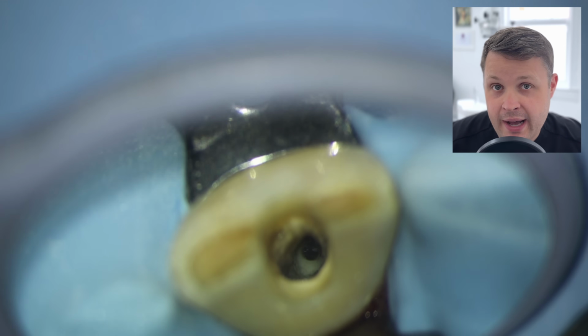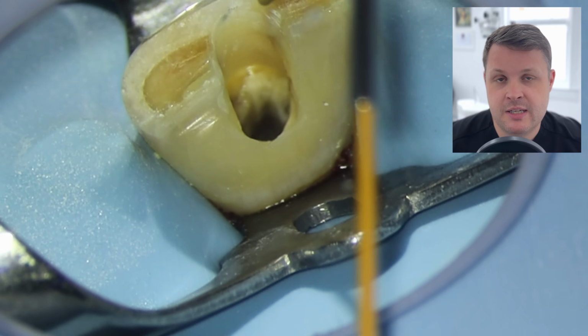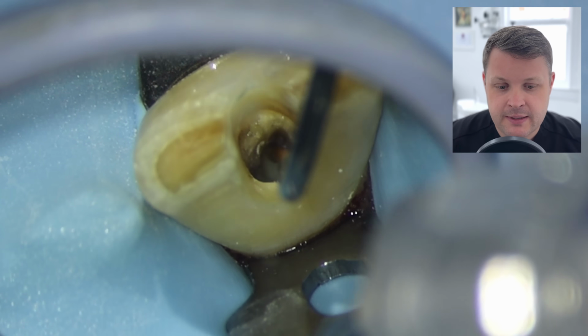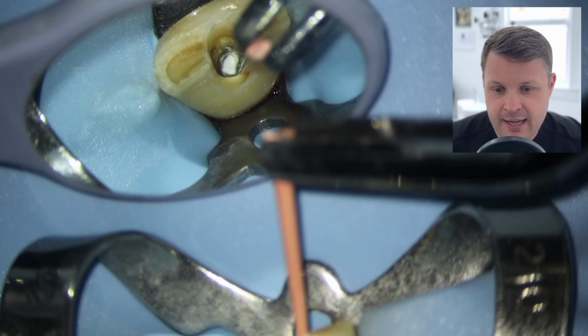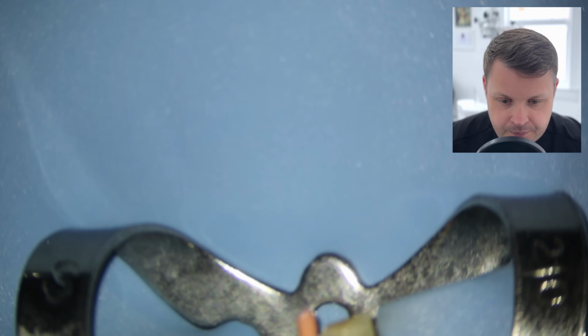So we're ready to do our final obturation of the main canal. I'm going to use one fill. This is a bioceramic sealer directly injected into the canal space. And once we have filled that all the way to the top, I'm just going to use my matched GP cone, and I'm going to very, very gently push this to length.